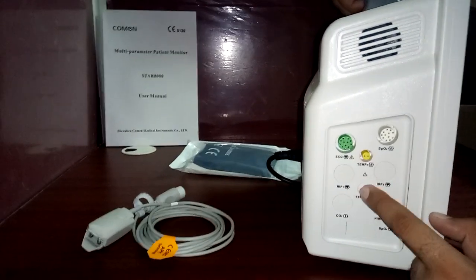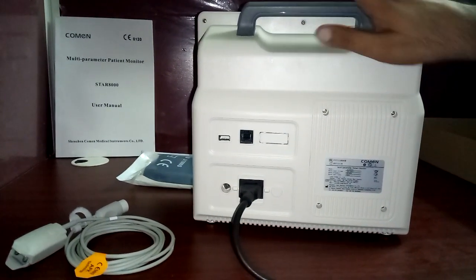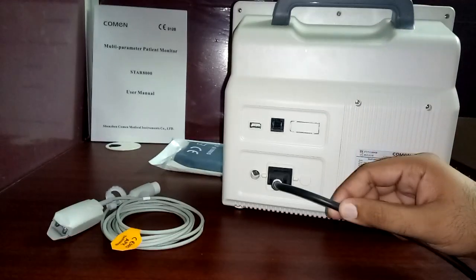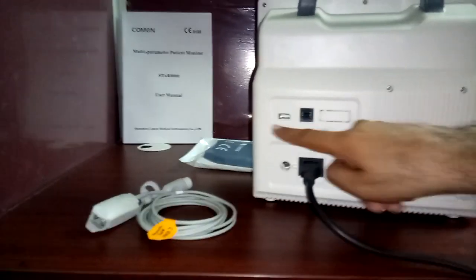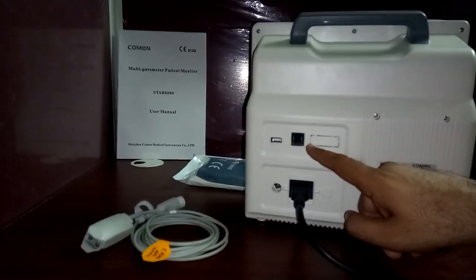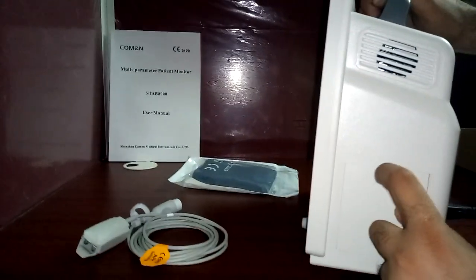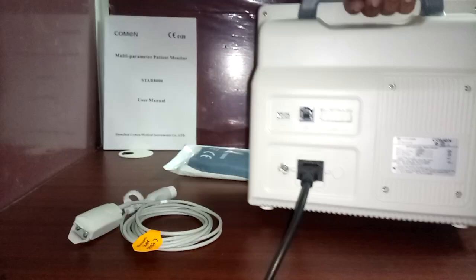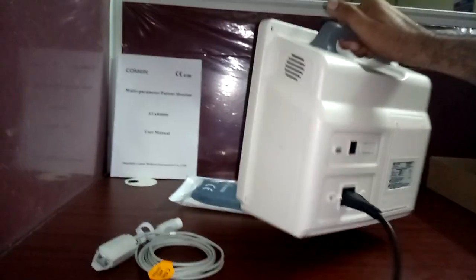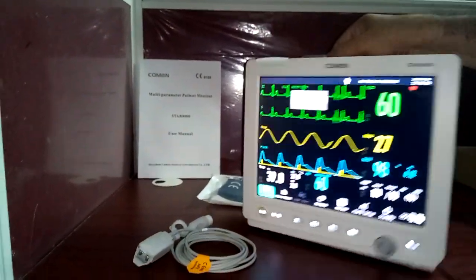On the back side, you can see this is a CE-approved monitor. There is the mains cable connection port, an earthing port for the earthing cable, a USB port for data, a central monitoring port for connecting to a central monitoring system, and a port for the optional recorder/printer. The monitor has a handle and is very lightweight — I'm holding it with one hand.